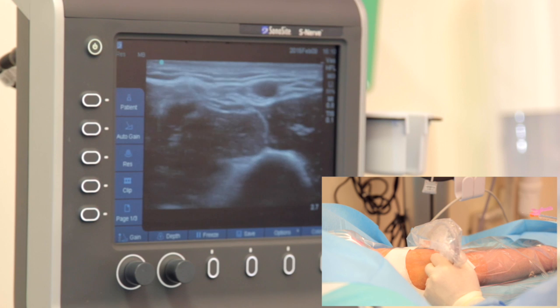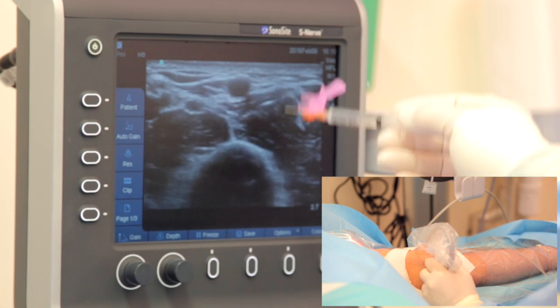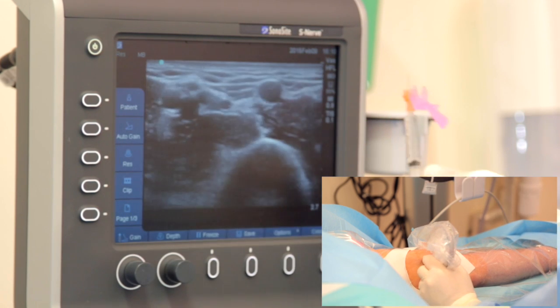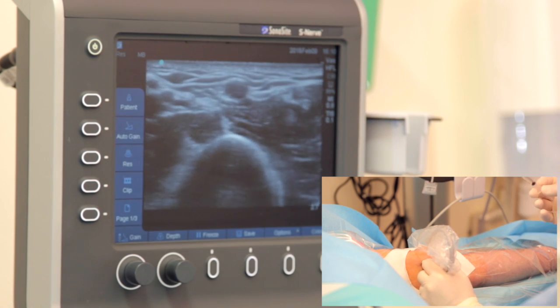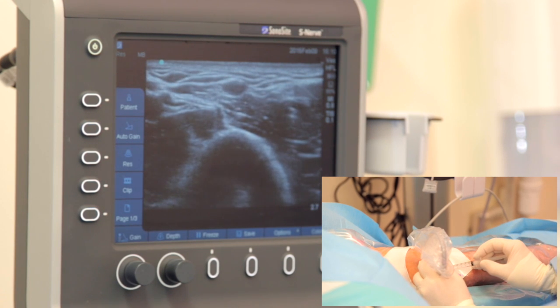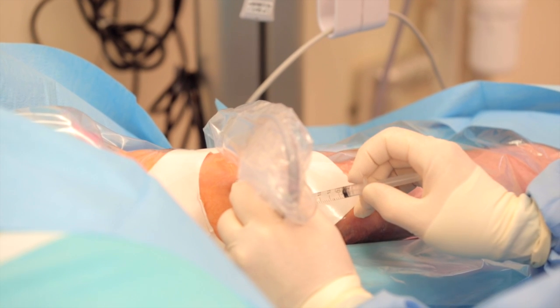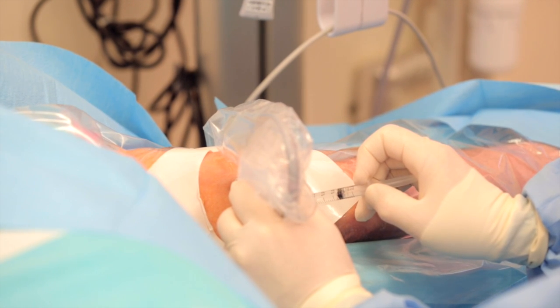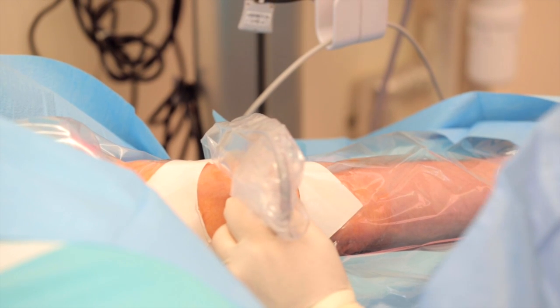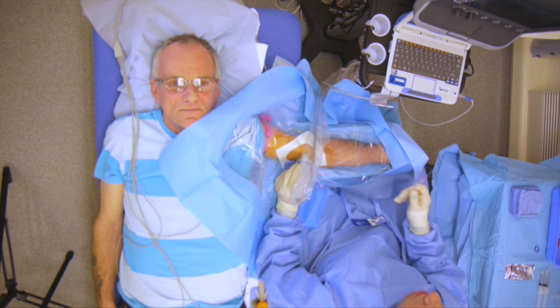Finding an appropriate site for PICC insertion — just here would be nice. I place the vein in the centre of the screen from left to right, not to either side, so that the local anaesthetic goes right under the centre of the probe. Administering local anaesthesia to numb the skin — a very sharp scratch. It stings for a moment and then it will go numb. We give the local anaesthetic a moment to work.